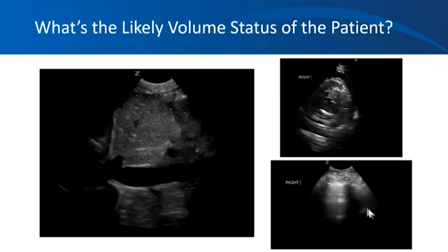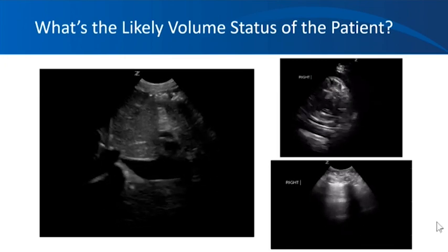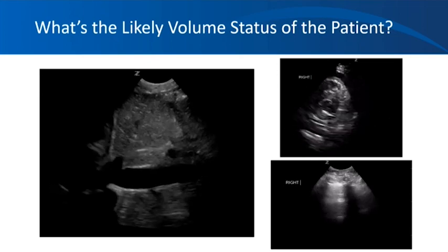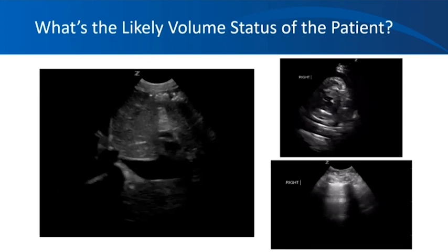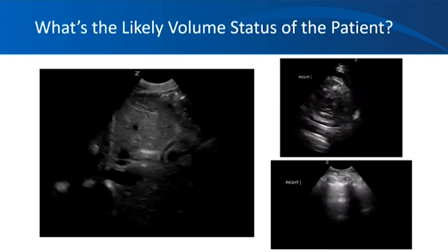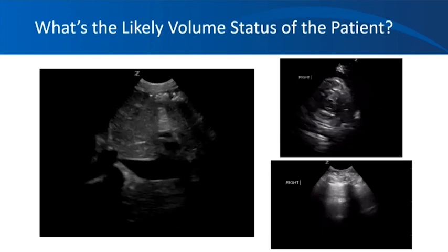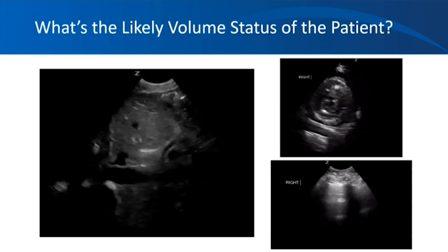And here in the lung ultrasound, you see A lines, that is horizontal lines, which represent air in the lung and not fluid. So taken together with hyperdynamic left ventricle, completely collapsing IVC, and A lines in the lung, most likely suggest hypovolemia if your clinical picture correlates.